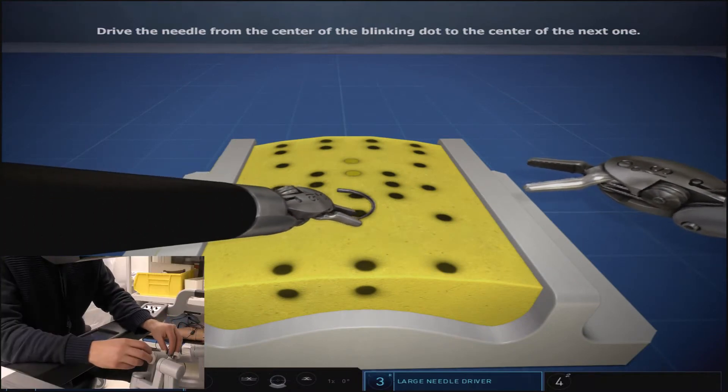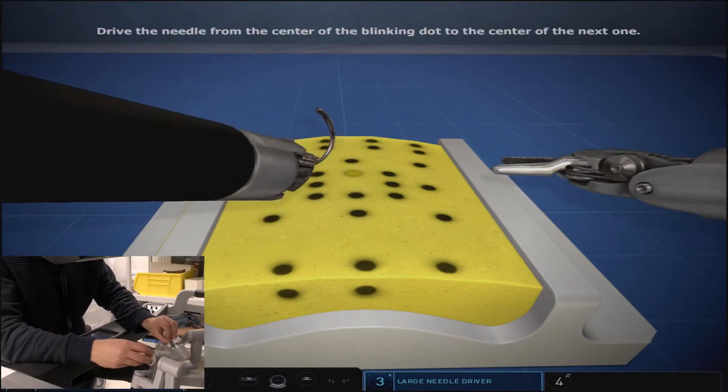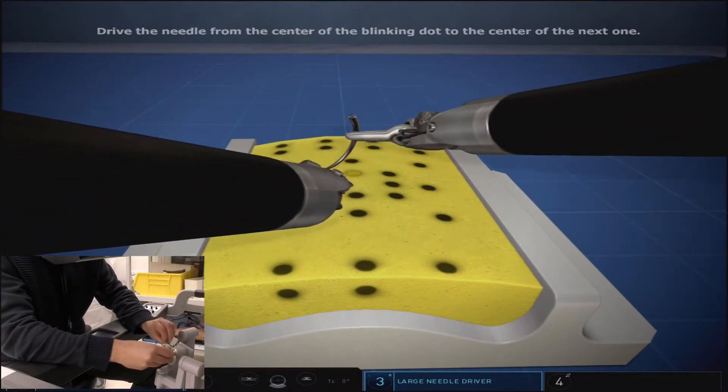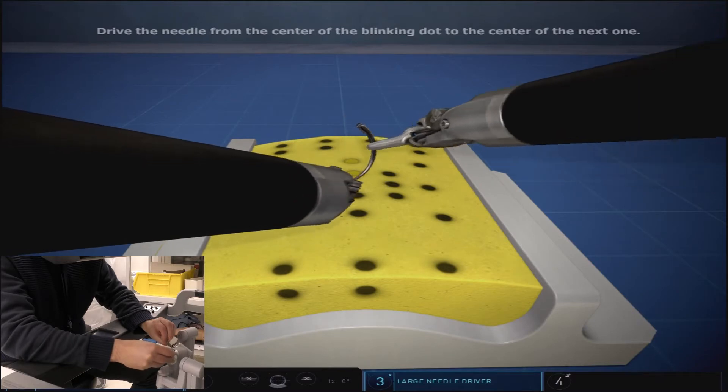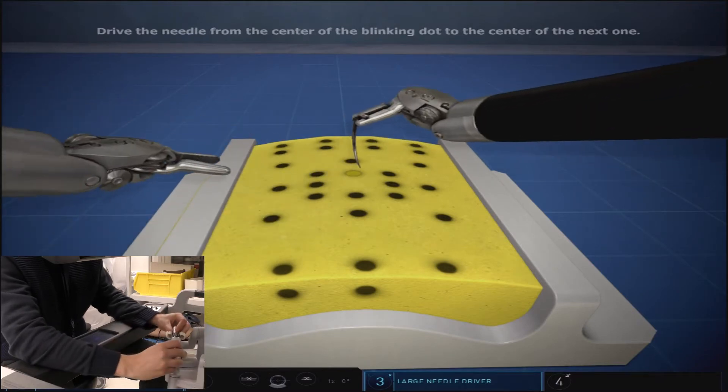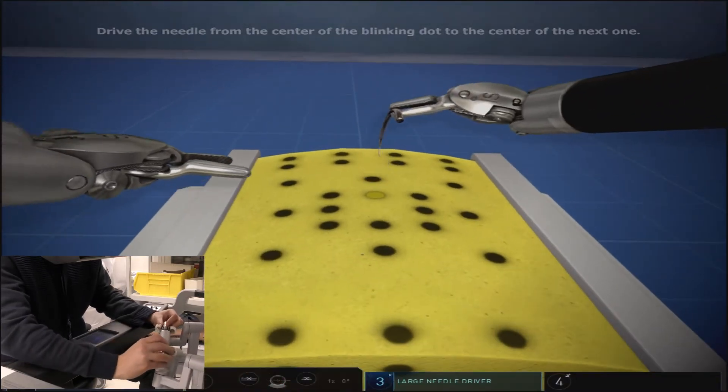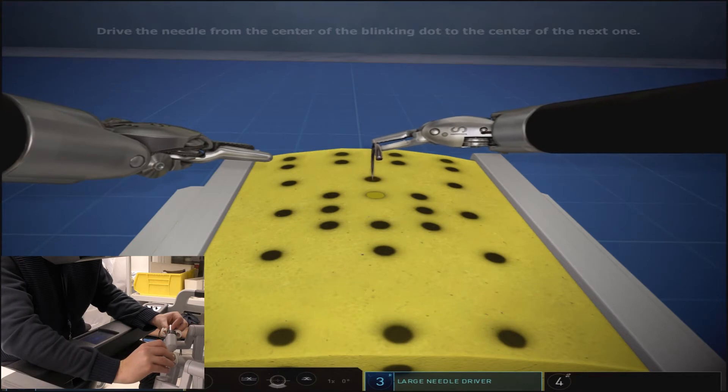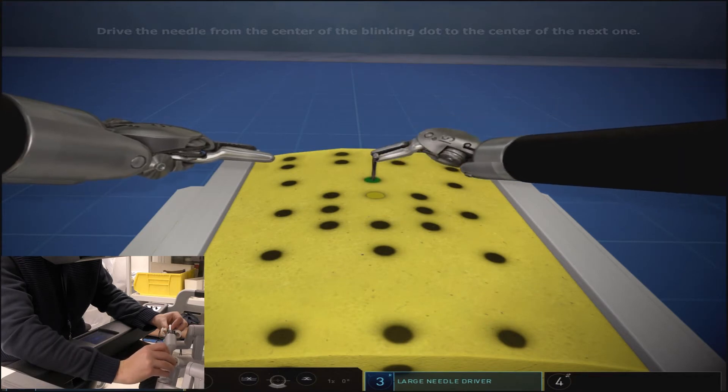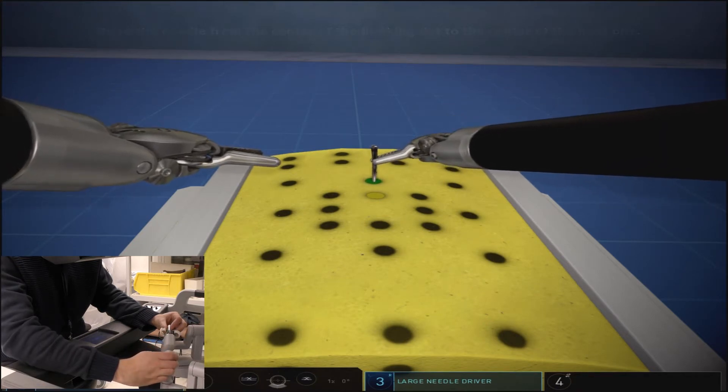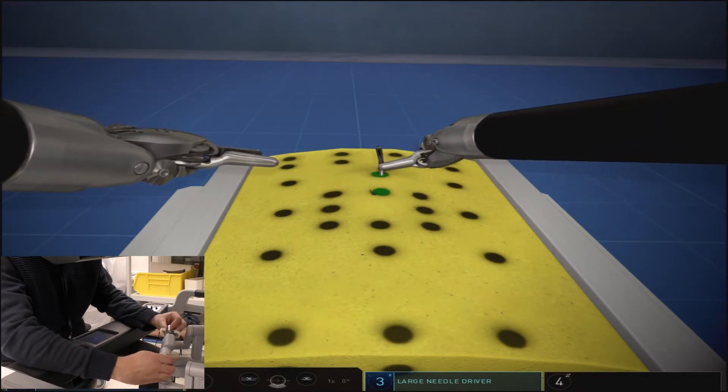This exercise requires you to suture from an outside to in fashion and the needle throws will be done in a counterclockwise order. You'll start this exercise in the 12 o'clock position.